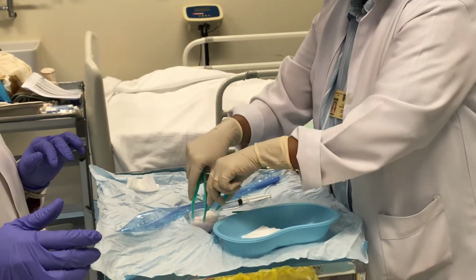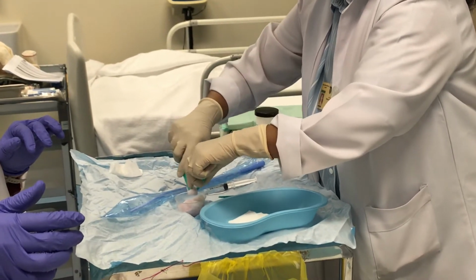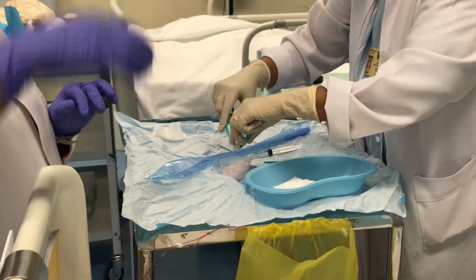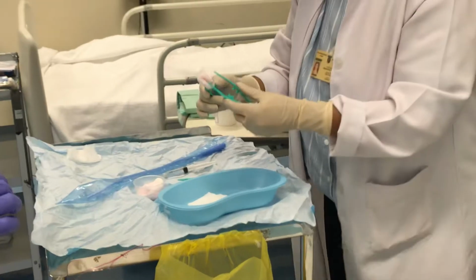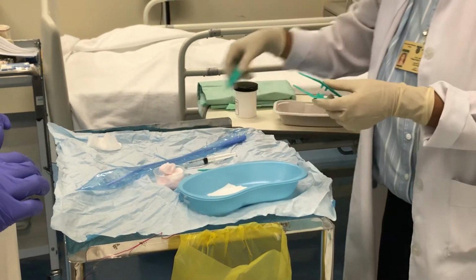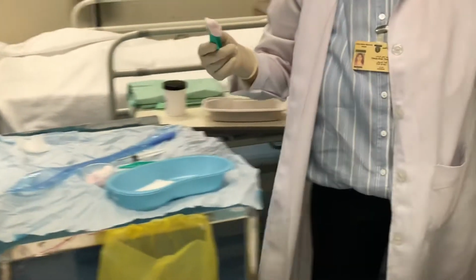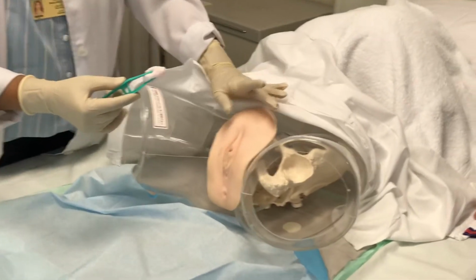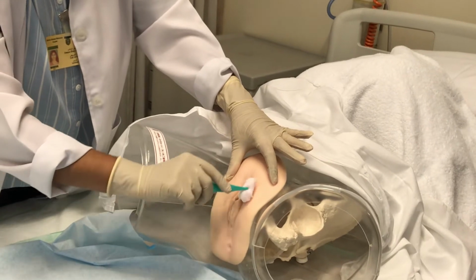So it's already soft. No need to squeeze. Even if it is dripping, no problem. What I will do is, actually it should come to the other side. No problem. Okay, what I can do is my hand is going to be unsterile, this hand, because I'm going to touch it firmly. And first I will start with the labia majora.